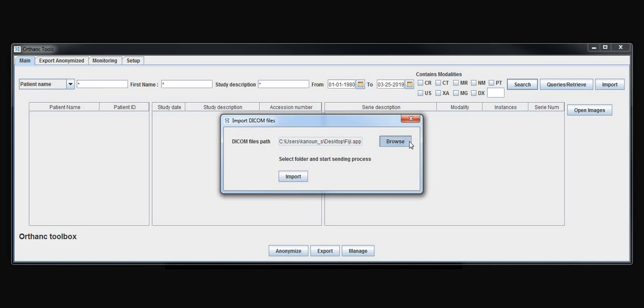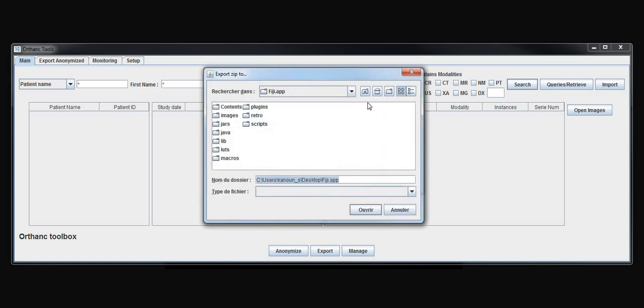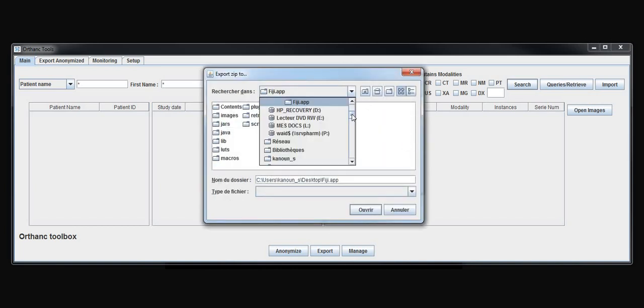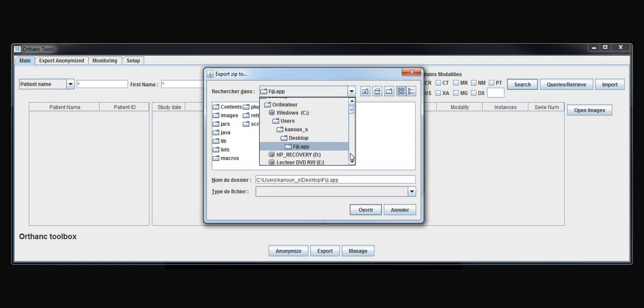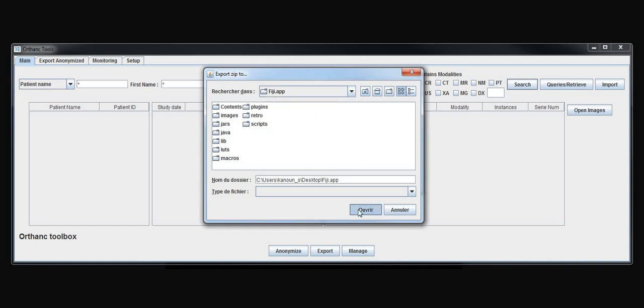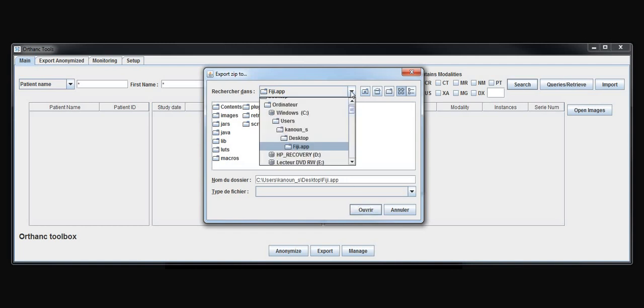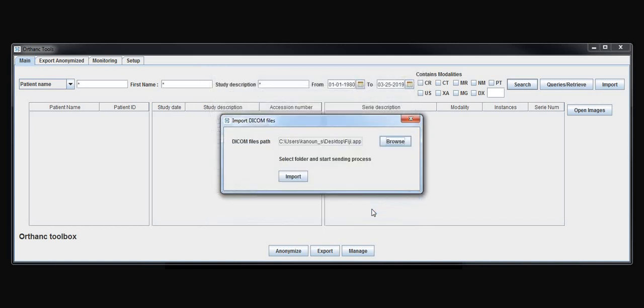I just want to show that I can bring DICOMs into Orthanc. I have to choose a folder where I have DICOMs. Unfortunately, I don't have DICOMs in this folder. However, I will show you the idea.